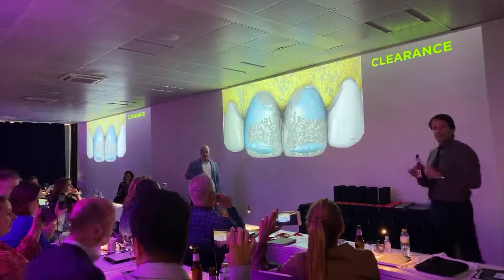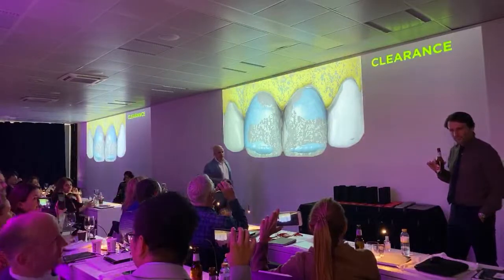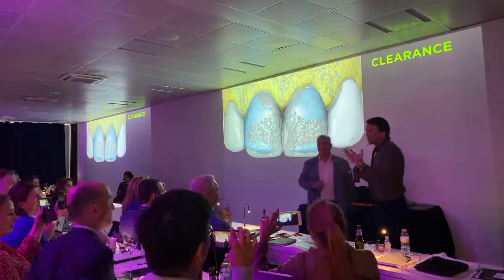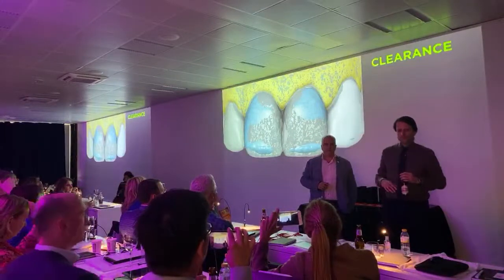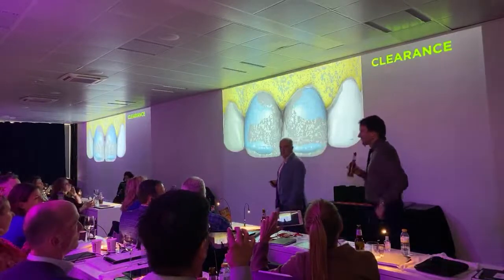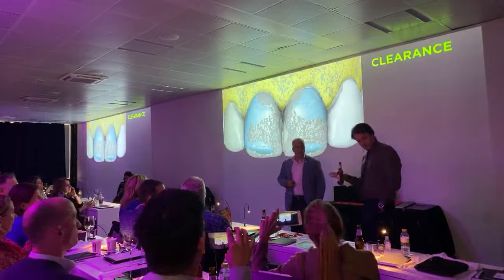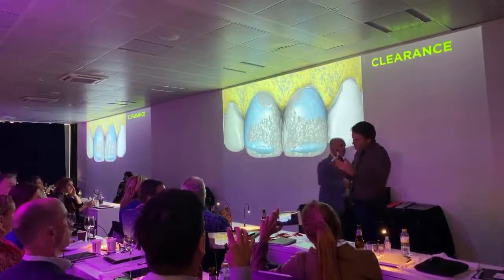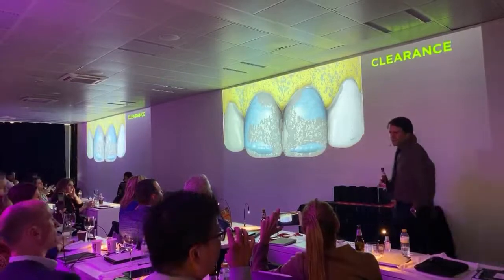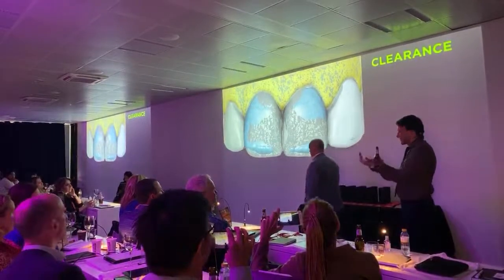When you order the guides, exactly. No, the stump shade, I mean, the tooth color before prepping is enough. Then when you prep, take pictures again. That's some extra information. Sometimes it changes a little bit. Reconfirm, but usually it doesn't change that much.